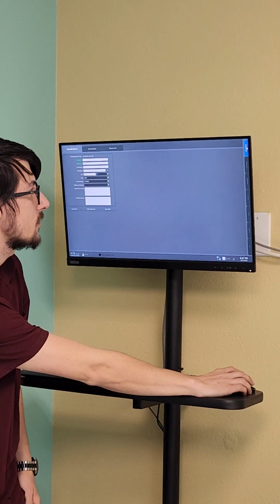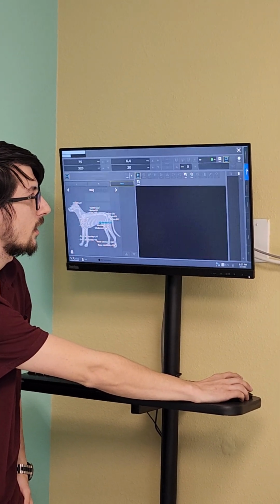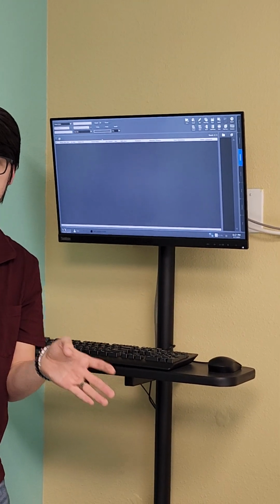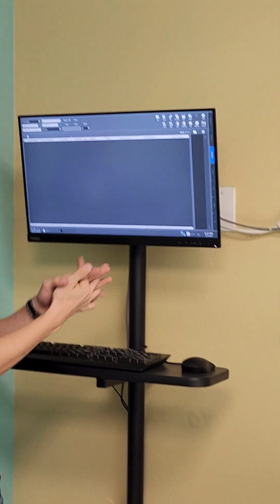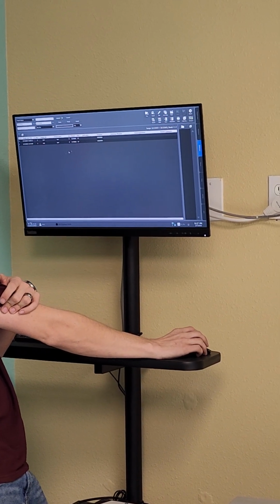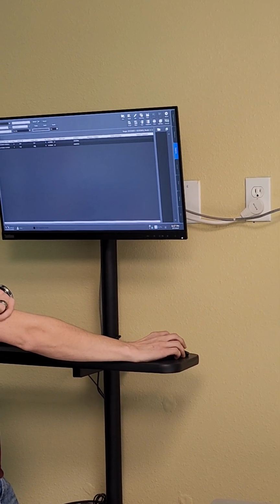And then, so that's the registration tab. We already did the exposure tab. The database tab is where all your images are going to be saved. You can search through all your images. So if we go to today, these are our 2 tests that we did.